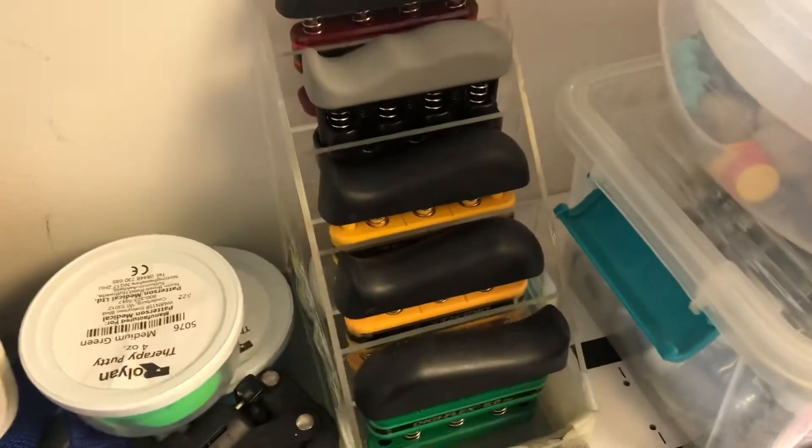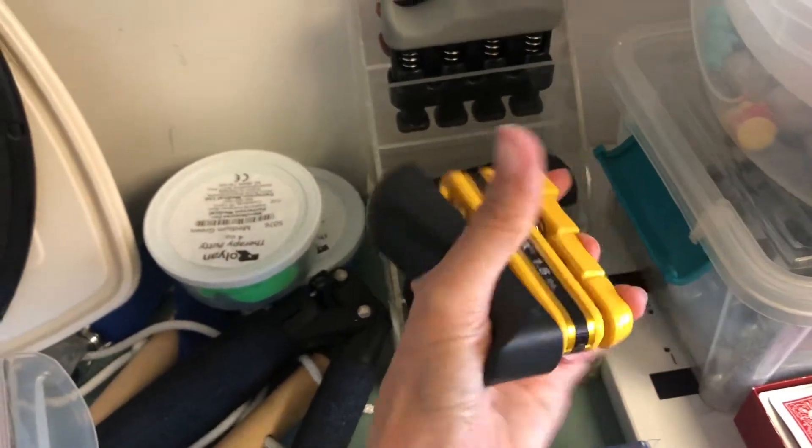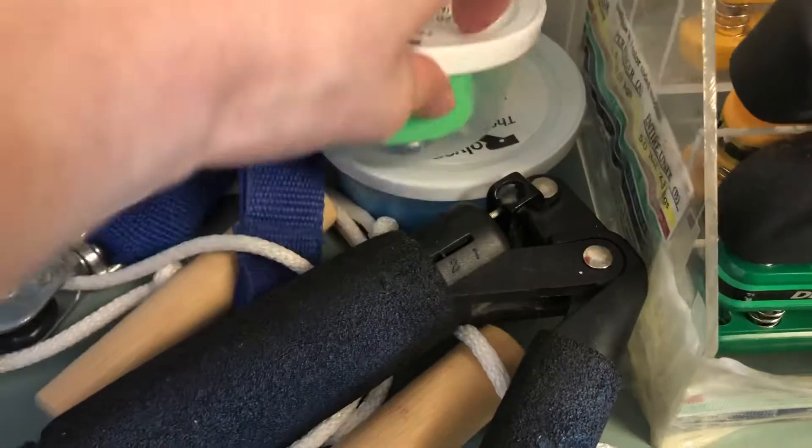We've got grip strength — strengthening the grip, of course. Putty as well.